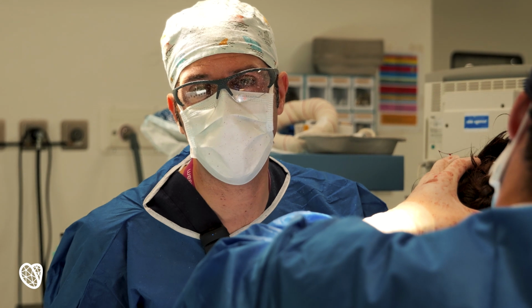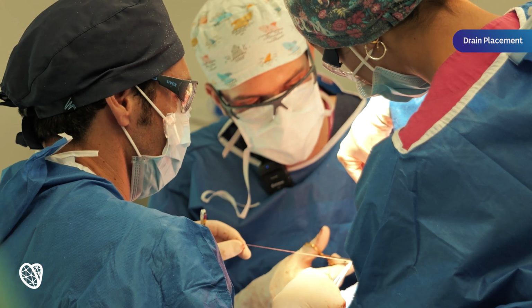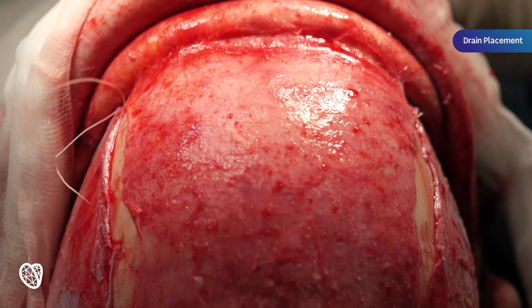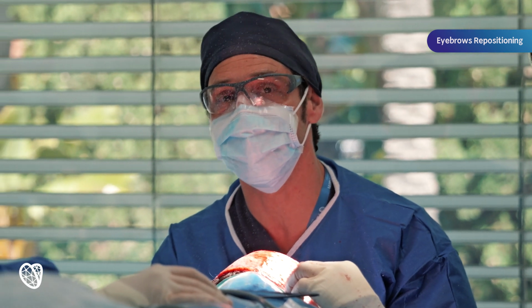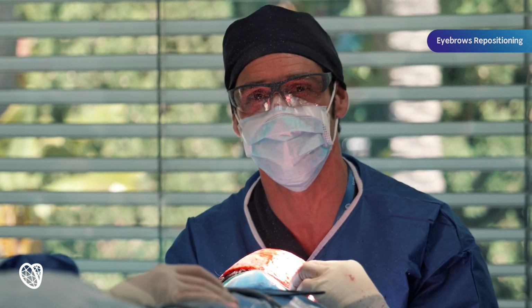We have placed the drain that we will remove tomorrow. Now we face the very final step of the procedure. We are going to reposition the eyebrows in a very slightly higher position. Let's go for it.